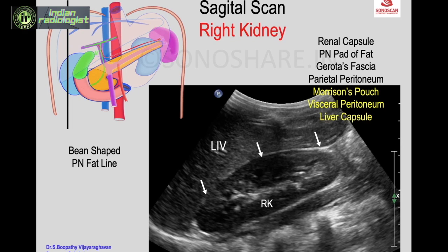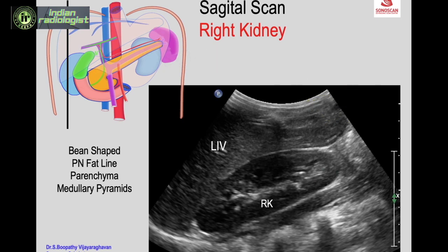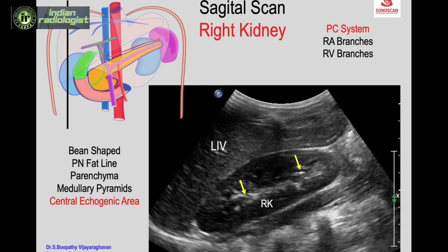Within this thin perinephric fat line you see the parenchyma, which is uniform in thickness all around, the medullary pyramids within the parenchyma, and then the central echogenic area. The central echogenic area, as the name implies, is the echogenic area in the center of the kidney. It contains the pelvicalyceal system, renal artery branches, renal vein branches, lymphatics, and sinus fat. Because of the interfaces between each of them, it appears echogenic.